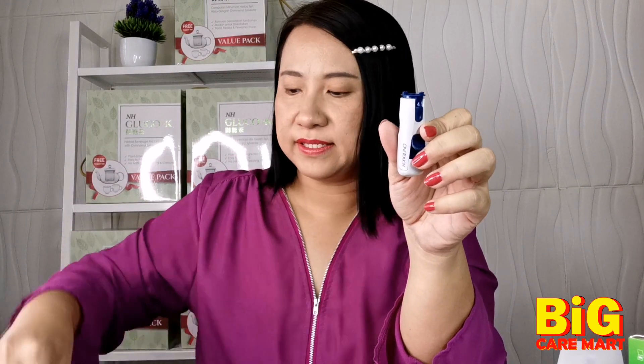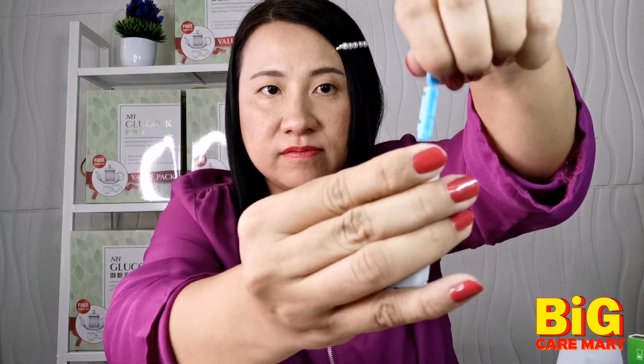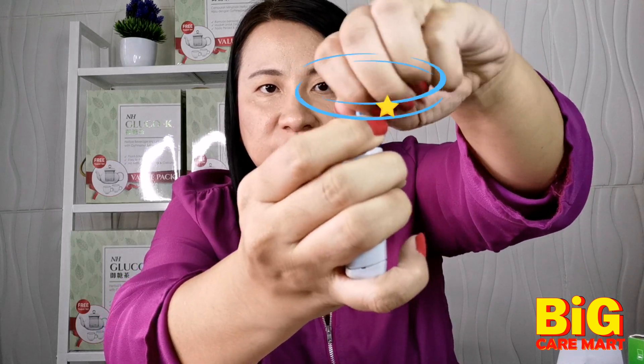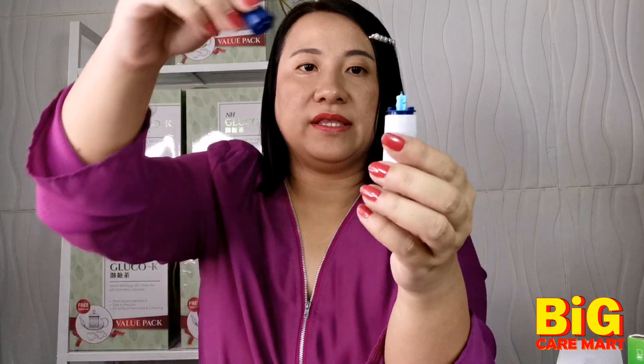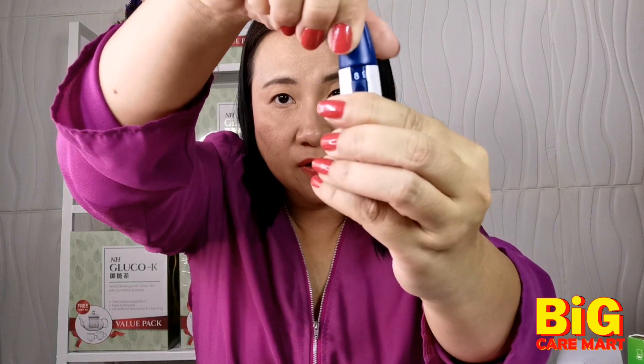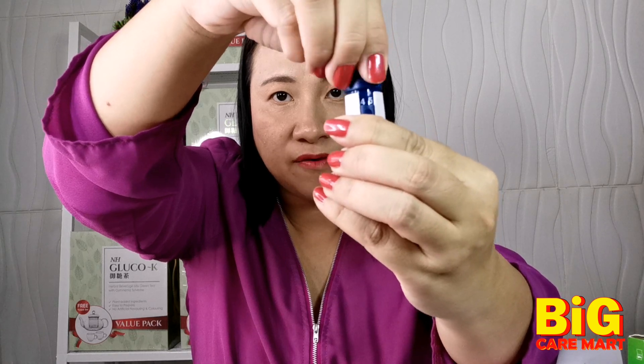For the demonstration, I'll use my own meter. First, you need to prepare the needle — you open this, put it inside, then turn and pull out. The needle is very very small. Try to get one with a very small needle so that it won't be painful. Then keep it back and you see the number here — the bigger the number, the more painful it's going to be when you poke. Around four or five will be enough.